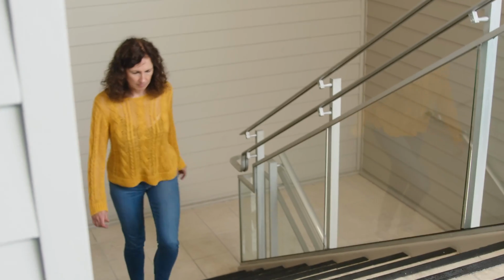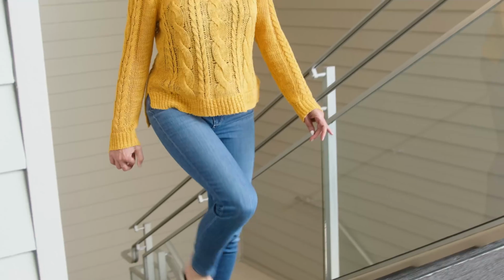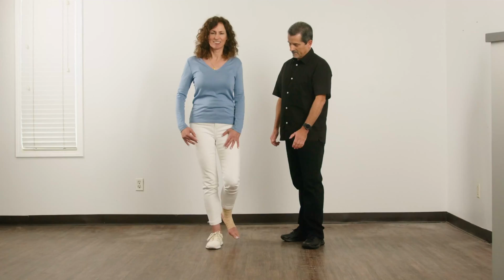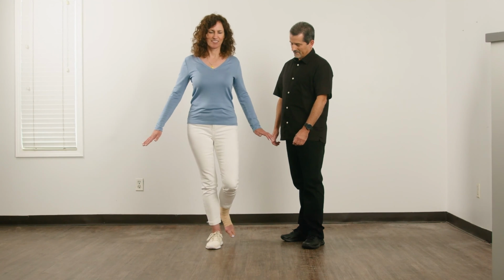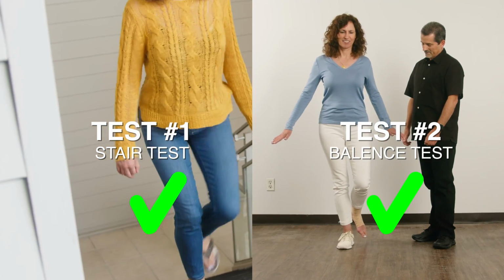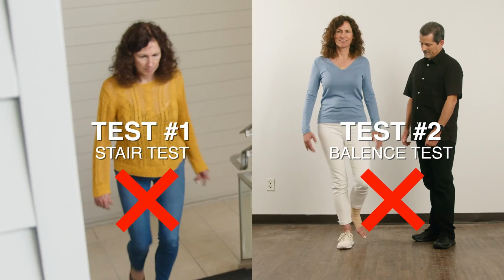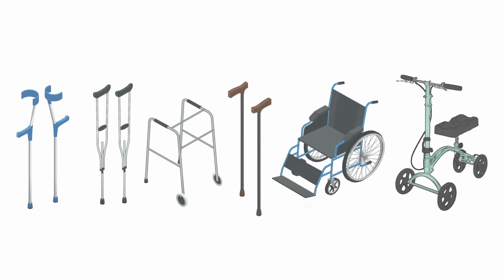Test 1. Before their injury, could your patient fluidly go up and down a flight of stairs at normal walking pace without using the handrail for balance? Test 2. Can the patient balance on their good foot for at least 30 seconds? If your patient can pass both tests, then they have the physical ability to use the iWALK crutch. If they cannot pass both tests, then they are not likely to adapt to the iWALK crutch and would be better off with a different mobility device.